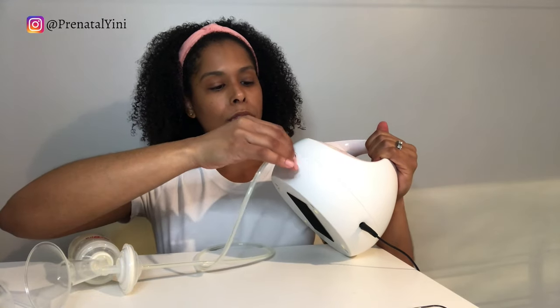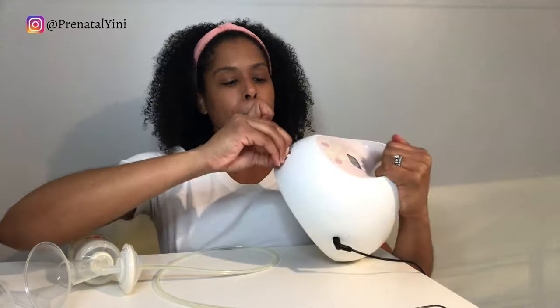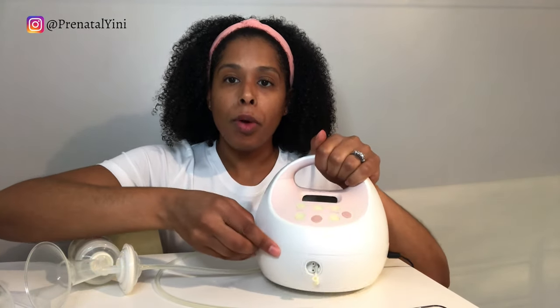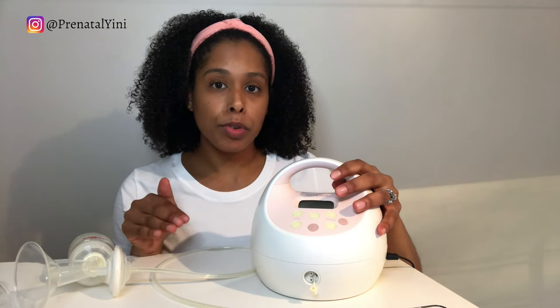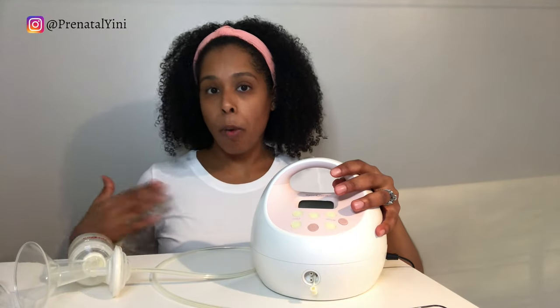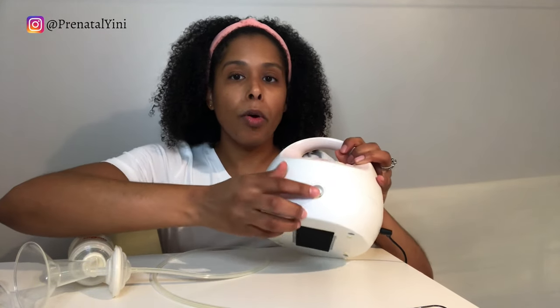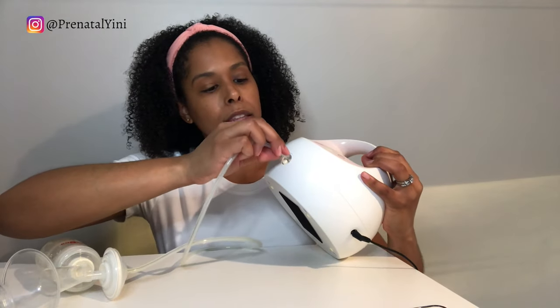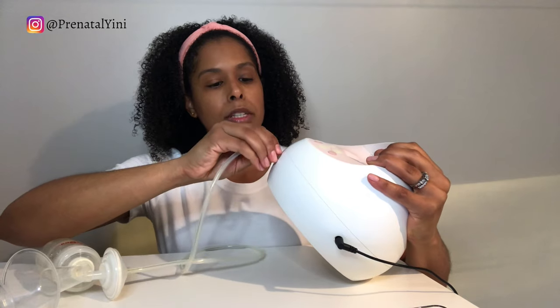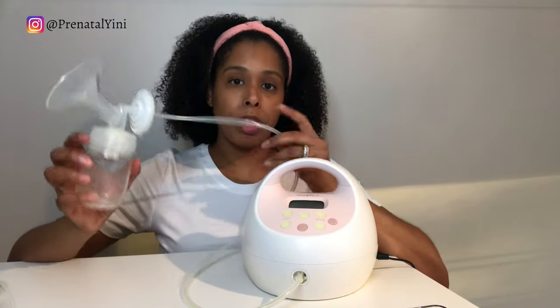The pump has two ports and a little stopper. You can single pump or double pump — I recommend double pumping to get the most milk. If you're breastfeeding on one side, you can single pump on the other breast, but you must close one of the ports when single pumping. Connect the tubing to the open port using a twisting motion, then repeat for the other set.